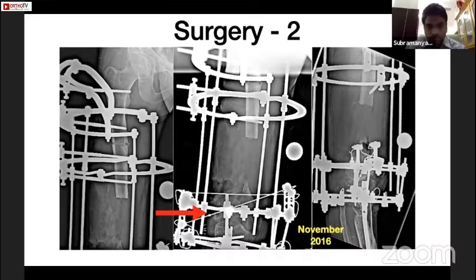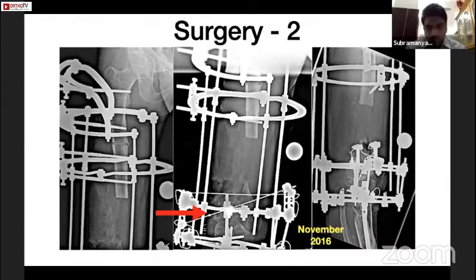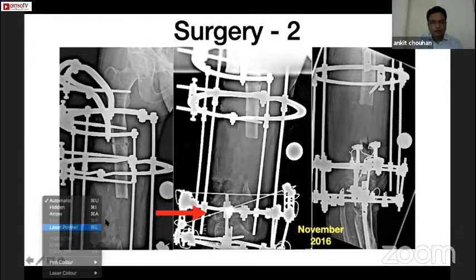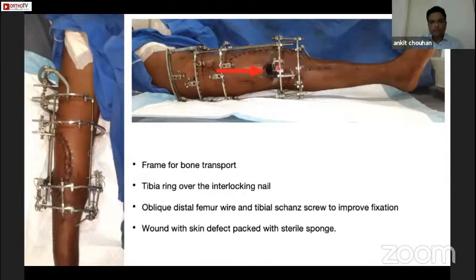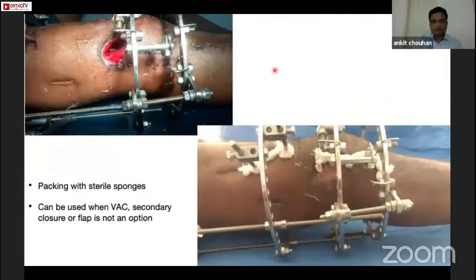So a bone transport frame was applied. I would like to point out the use of oblique wires, which can be used in places where bone stock is low or bone is osteoporotic — these oblique half-pin screws give a very good hold in such cases. The immediate post-op picture shows the frame for bone transport with the proximal tibia ring applied over the nail. I would also like to point out the use of sponges when dealing with skin defects. These skin defects can be packed with sponges which allows healthy granulation to form and can be used in cases where flap or skin grafting is not possible. With regular dressing, the wound healed by secondary intention.